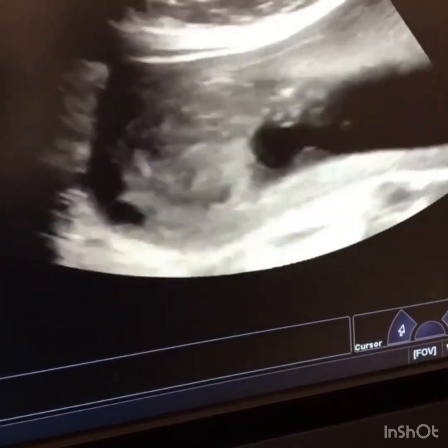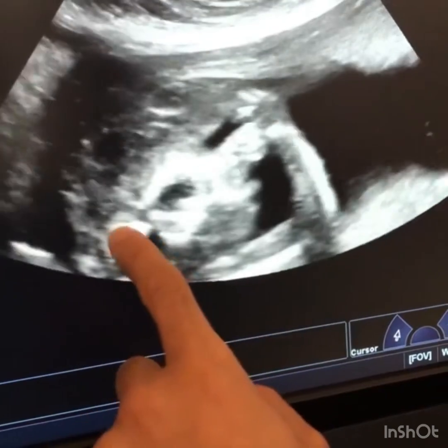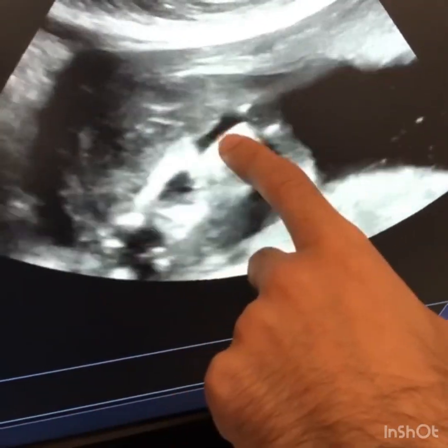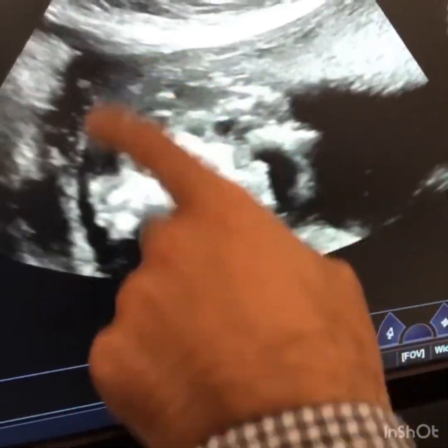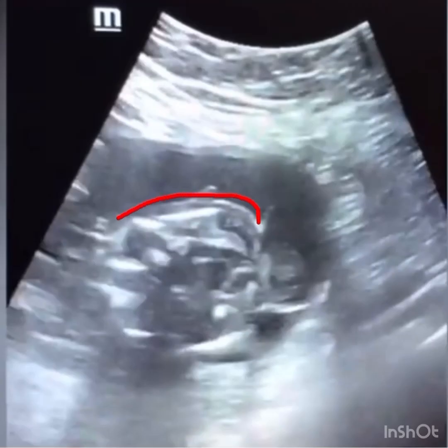Again, we can see the floating brain in amniotic fluid, which is even more anterior than the face. The third entity we want to review is encephalocele, which is a defect in the calvarium through which brain tissue or a cystic structure herniates.